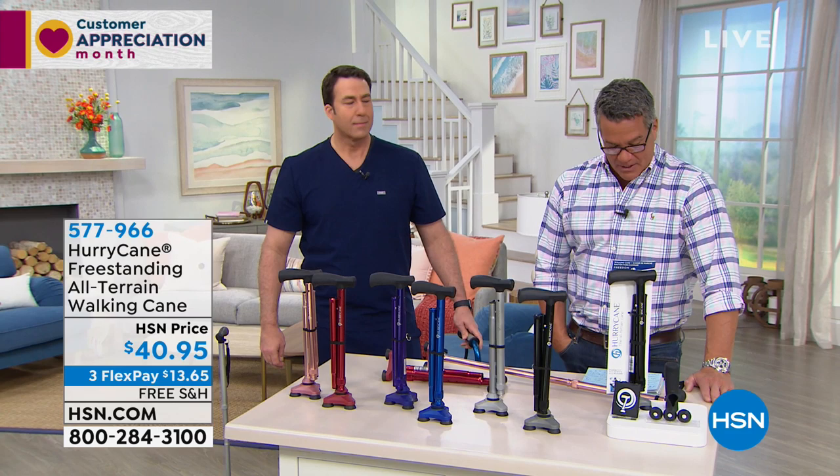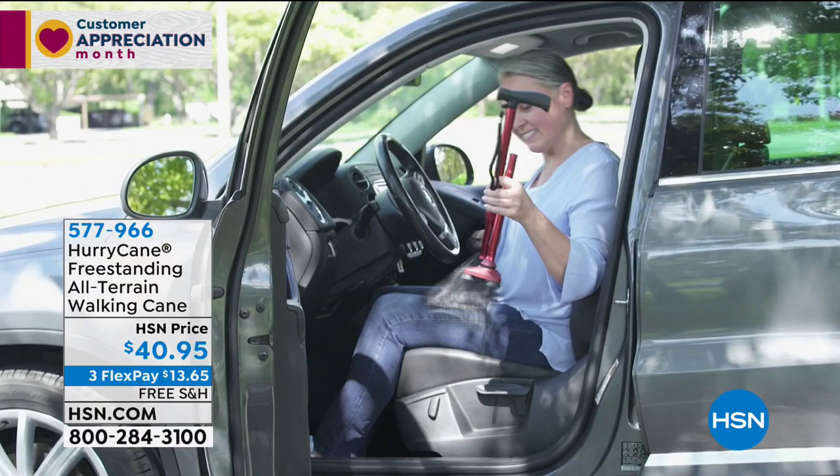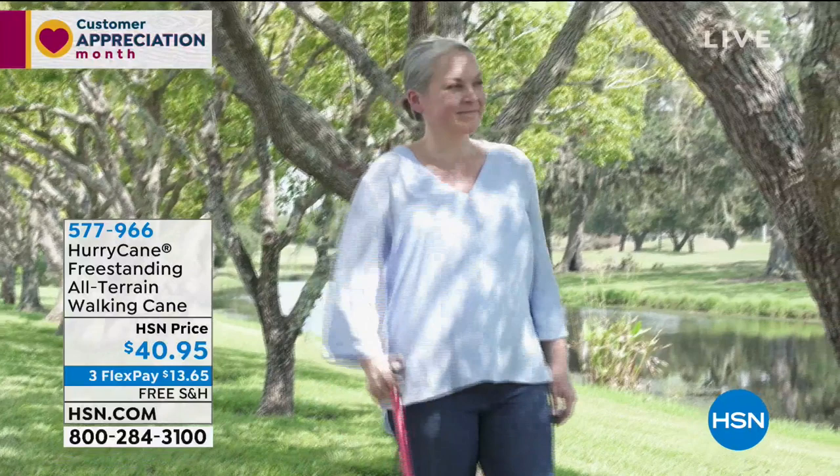Over 55-star reviews here, and this is a new model, so it's already getting great reviews again. It's totally adaptable and versatile — it goes anywhere you go as it adjusts to the conditions of terrain. Most canes just have that one point where if you don't get it solid on the ground, it's going to skid or slip. Well, this is a pivoting three-point base, which actually stabilizes and balances you as you walk.